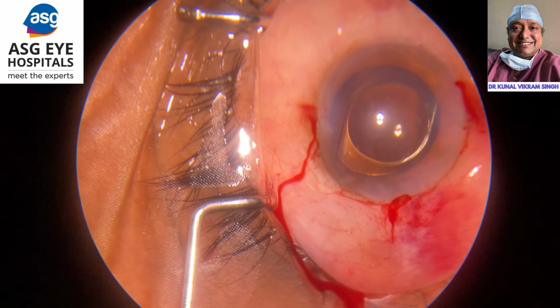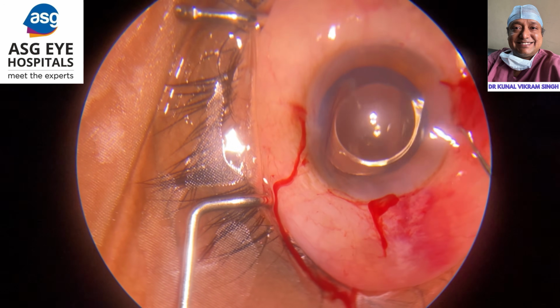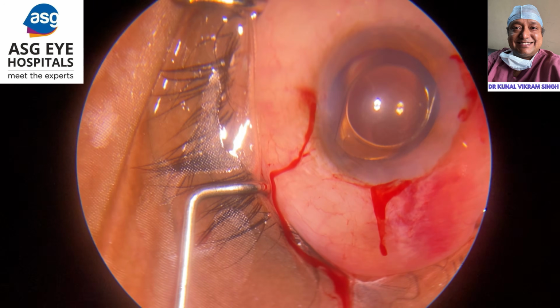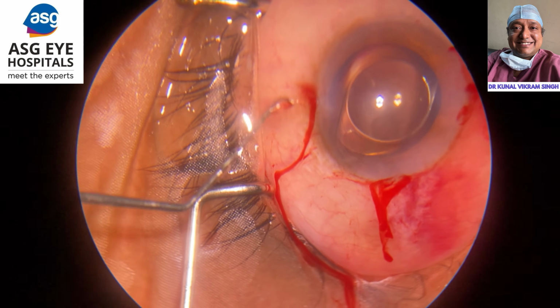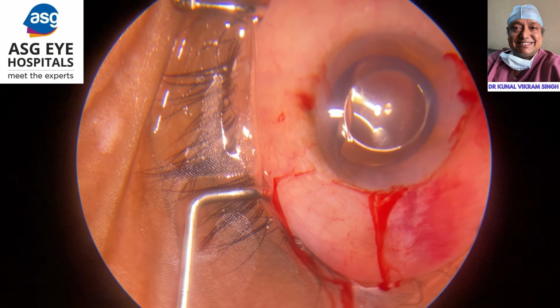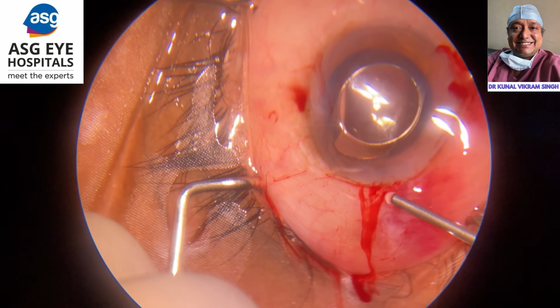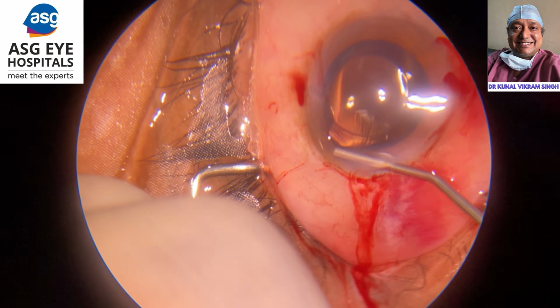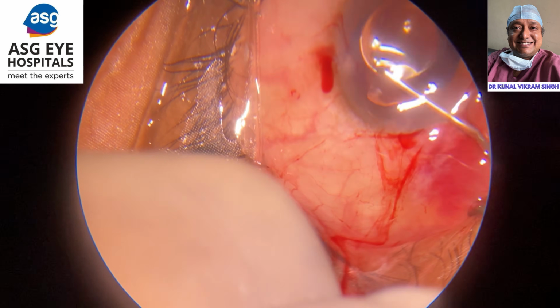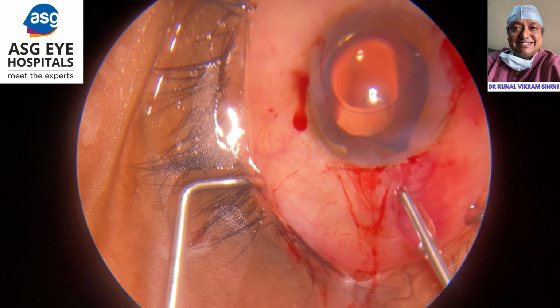But literally the IOL was plastered behind the cornea, and I did not have any space. So I was just running out of options. And this time I had this thing in my mind that this might be a case of aqueous misdirection. I checked the IOP. The patient was very cooperative, I would say. In spite of being under topical anesthesia, he was not causing a lot of trouble. But patients can cause problems at such stages, and it's not their fault.